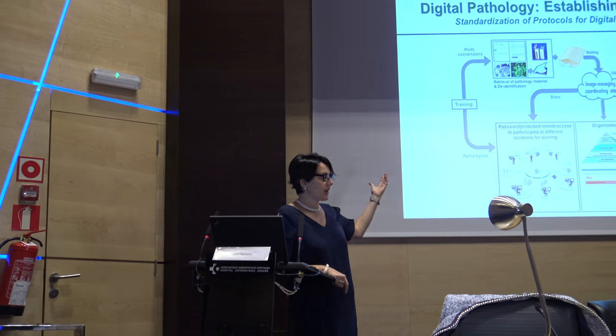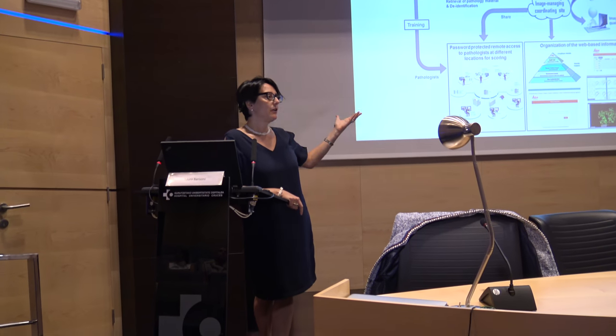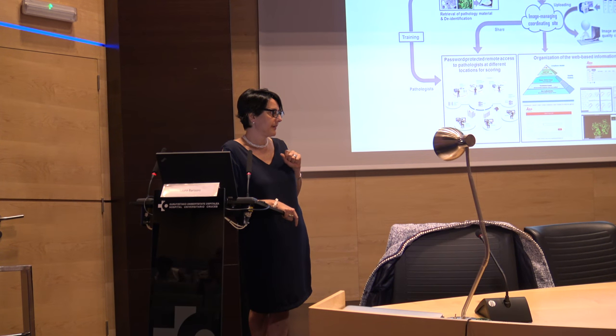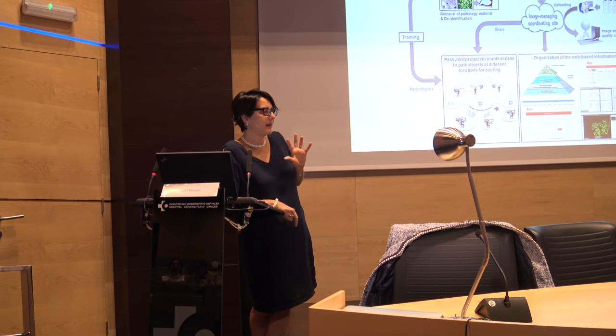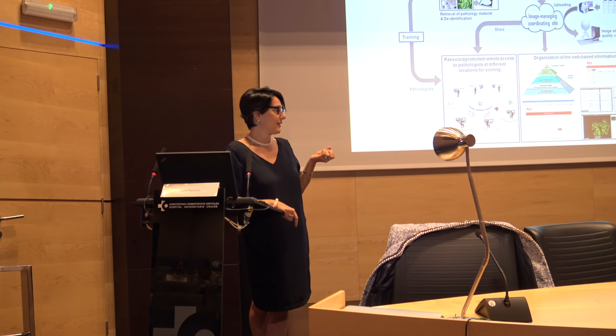One of the things that is key is standardization of protocols, and in KPMP we're working on it. We created a pilot study to look, for example, at how processes are standardized across the different centers and how the results compare. Because we all learn how to read through our imperfect slides. You can interpret your slides very well. If you give them to me, my eyes are not used to your H&E, for example, right?